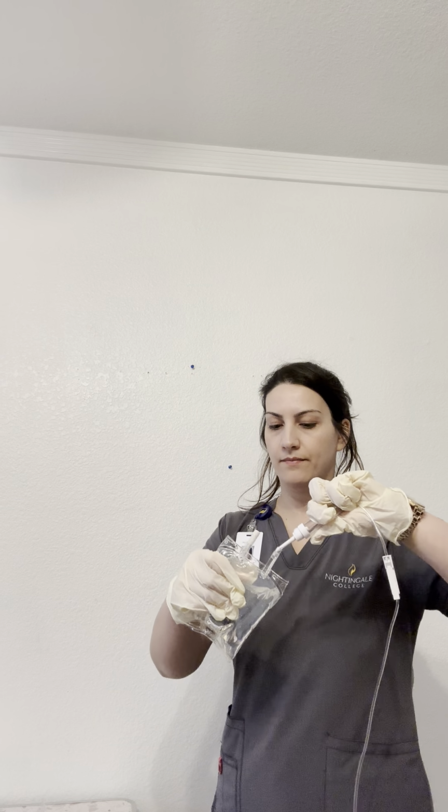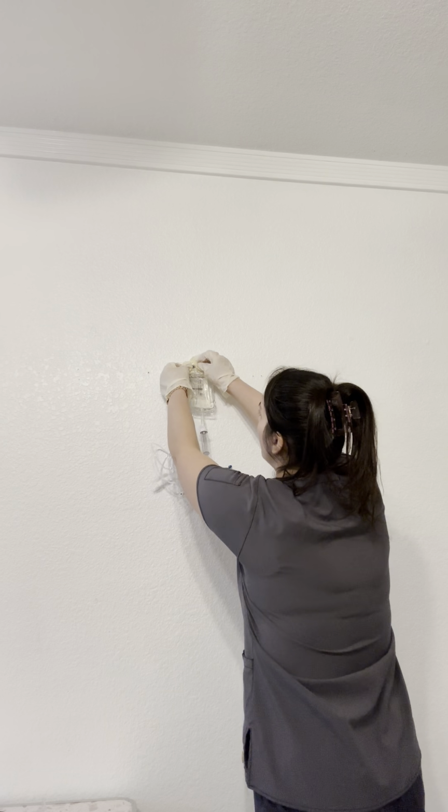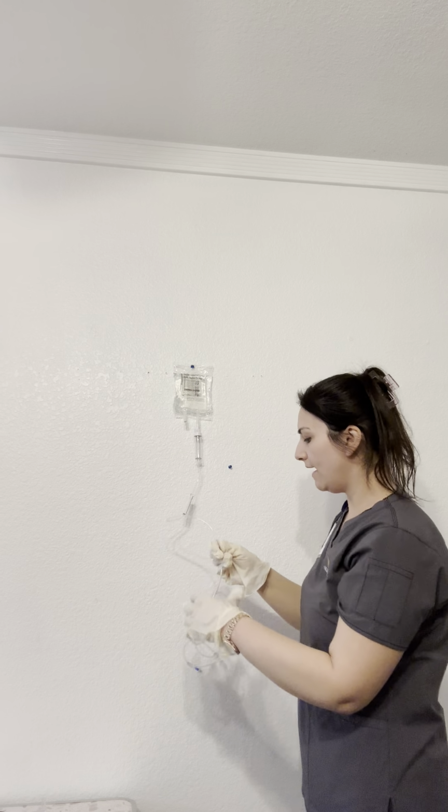We're going to make sure that we clip it inside here, and that this is closed so we don't have anything coming out. We're going to put it on the wall here. Okay, that's on the wall now.